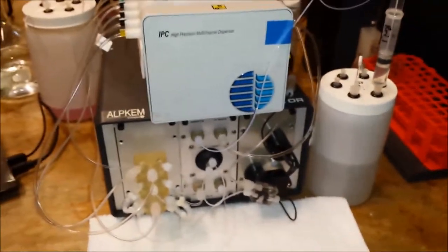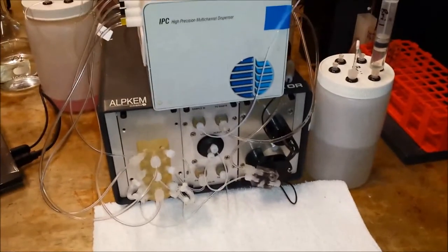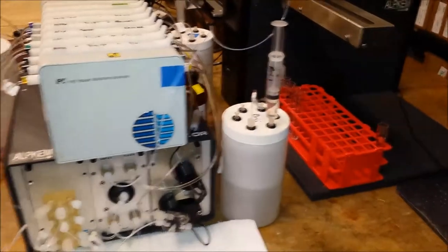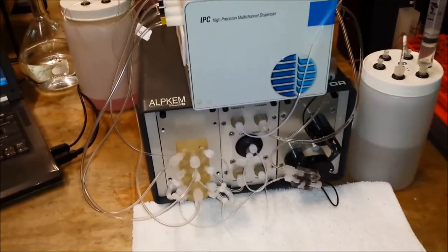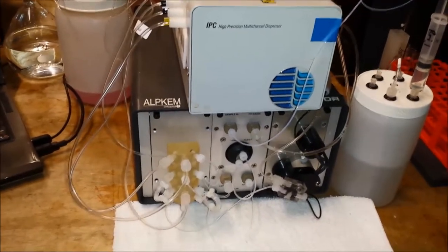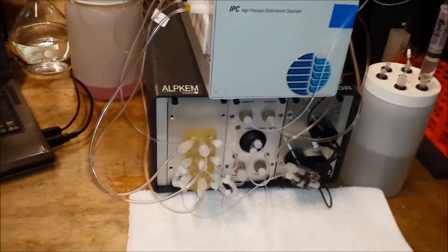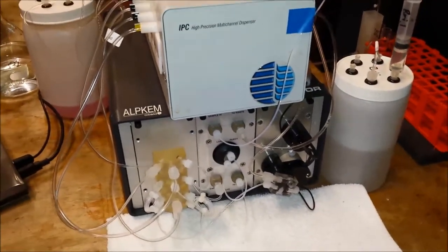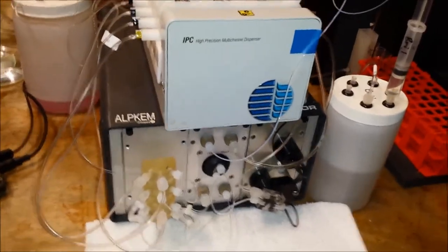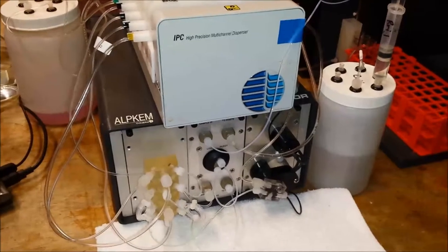Today we're talking about our ongoing series of troubleshooting problems with an autoanalyzer. The general principle is we always want to know whether an issue is mechanical or chemical, because knowing which one it is leads you in the proper direction. If the problem is mechanical and you're changing reagents, you're not solving the problem. If the problem is reagents and you're checking the detector, then you're not making any progress.